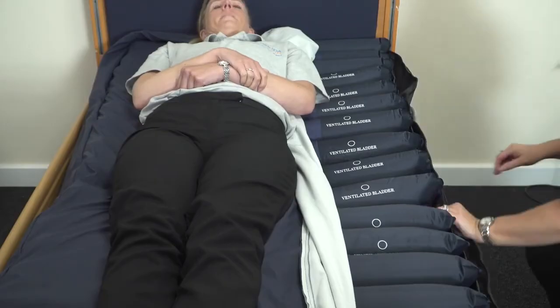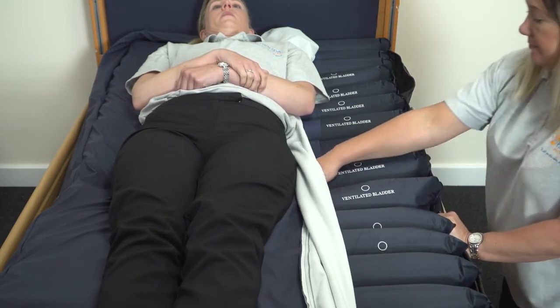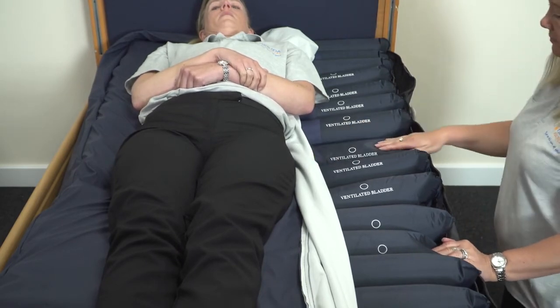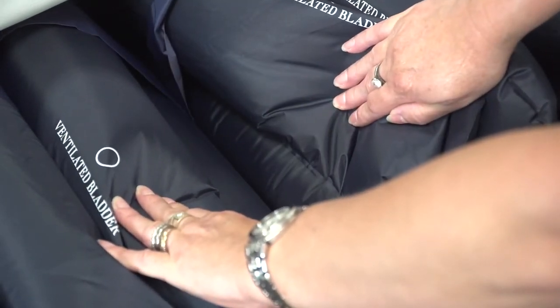Now we can have a look at the dynamics in more detail. As you can see, the patient currently using the Ayrshire is in the supine position. You can also see that every other cell is deflated. As I place my hand between the body and the deflated cells, we can feel and see that there is sufficient clearance, providing the patient with relief. The rapid cell deflation system is unique, as pressure relief happens much quicker than on a standard dynamic system, offering immediate relief. The Herida Ayrshire has a second layer of static cells underneath the alternating cells, which prevents any bottoming out onto the bed frame. The second layer of cells are inflated at all times, giving the patient the comfort and support they require.